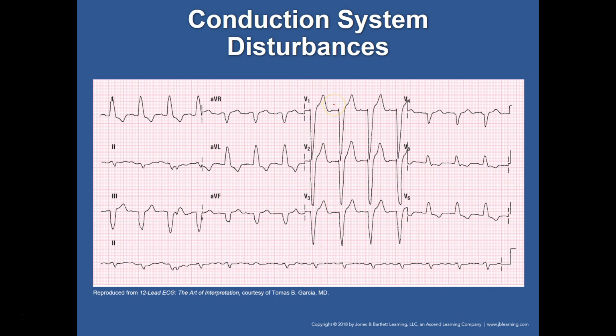So here we go. Okay, a little midstream adjustment here. If it sounds sketchy, it's all right. Looking at this one, here's our QRS, and we get into our ST segment here. Where the QRS ends and the ST segment begins is what we're looking for. That's going to be our J point. We go back, and you see here, we're coloring down. So in your car, if you push your turn signal down, you're going to be turning left. So once again, J point backwards, and if you go up, it's turning right. If you go down, you're turning left. That's a quick and simple way.